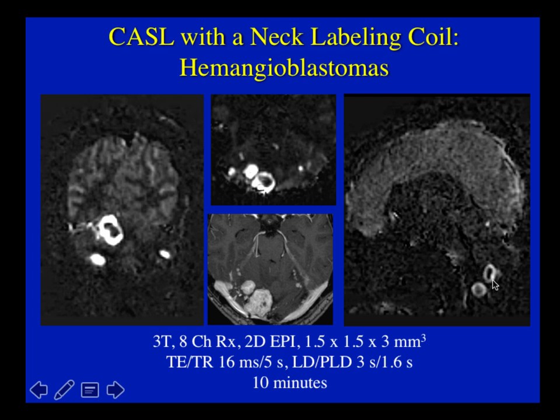And this patient also had some tumors below the cerebellum, and we were able to see that.